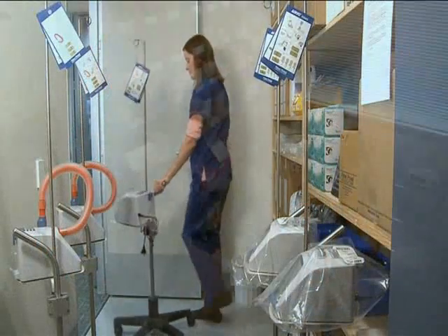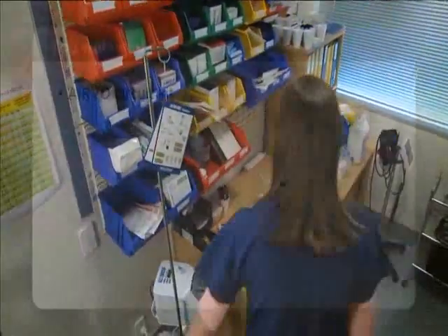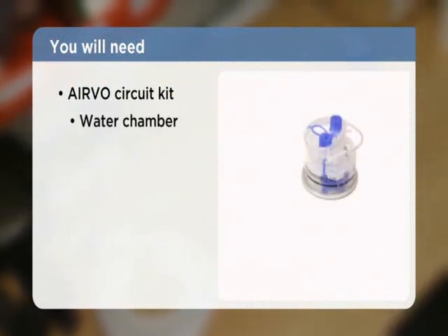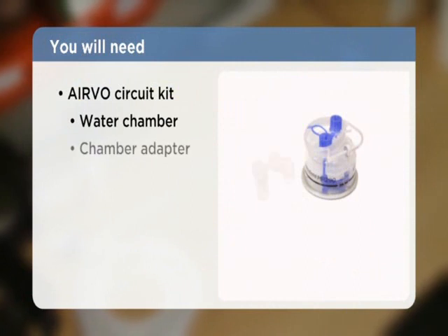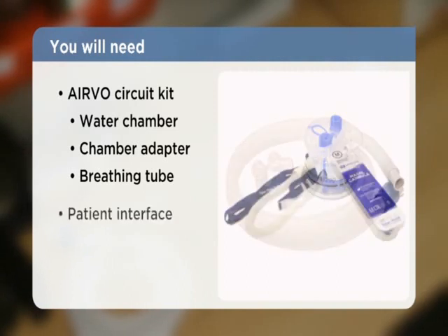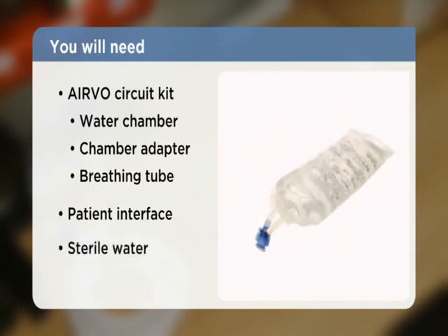Along with the AIRVO humidifier, we need the consumable accessories: an AIRVO circuit kit, which contains an auto-fill water chamber, a water chamber adapter, and a heated breathing tube; a patient interface from our range of nasal, tracheostomy, or mask interfaces; and a bag of sterile water. These consumables need to be replaced both for every new patient and at least every seven days.